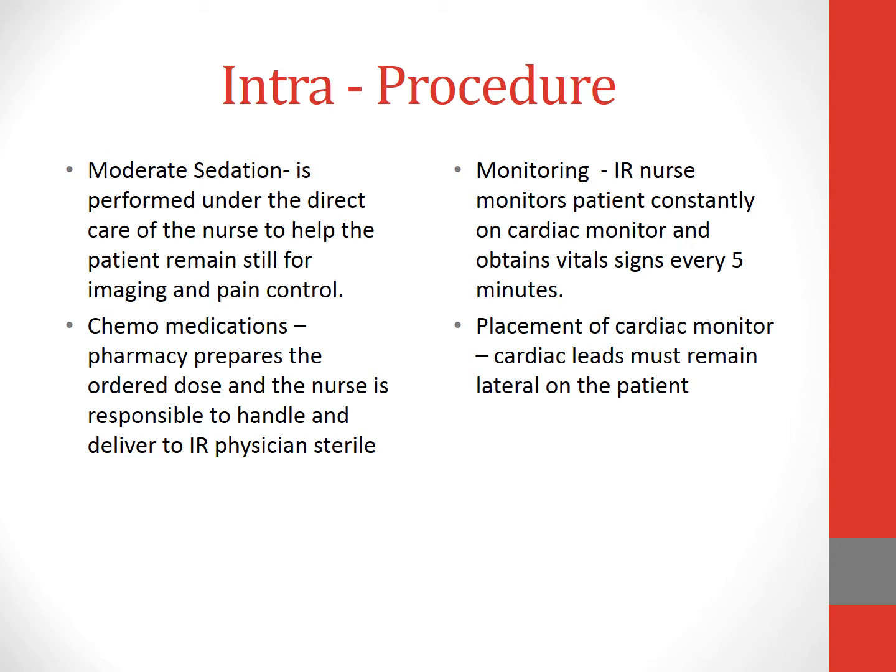In the intraprocedural phase, this patient will be receiving moderate sedation for 2 reasons. They need to remain still for the imaging purposes, and we need to control their pain. The pharmacy will mix the chemo medication, and it's part of the intraprocedural nurse's responsibility to make sure that's ordered correctly. And you need to understand how to deliver that chemo drug to the IR physician sterilely.